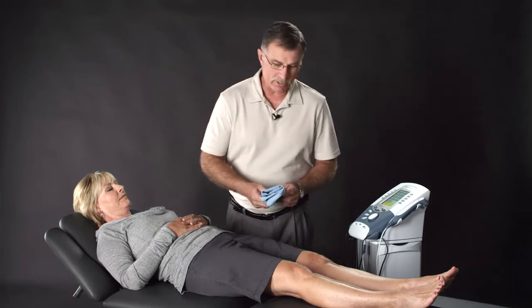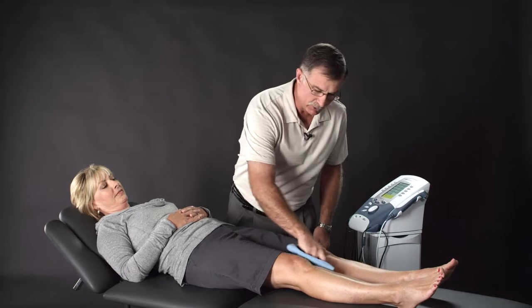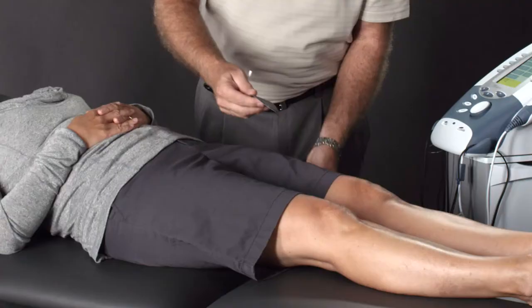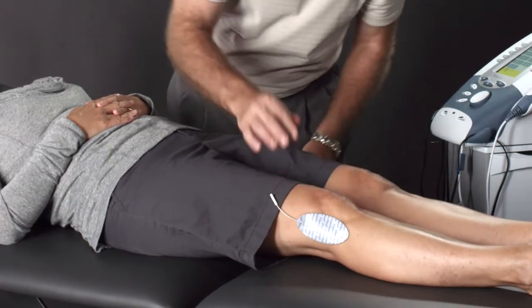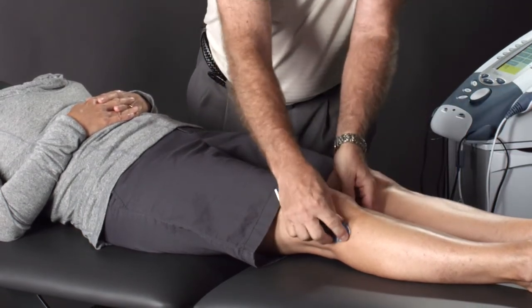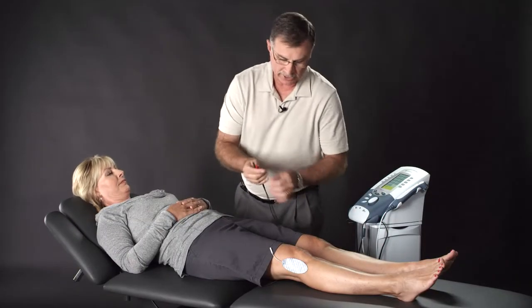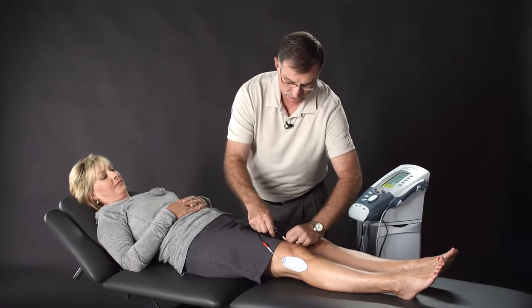At this point, we want to prep our patient's skin with our warm washcloth in the water to remove any excess oils. We then want to take our electrodes. We're going to place them on either side of the knee. And now we're going to take the lead wires from channel 1 and plug those into the electrodes.